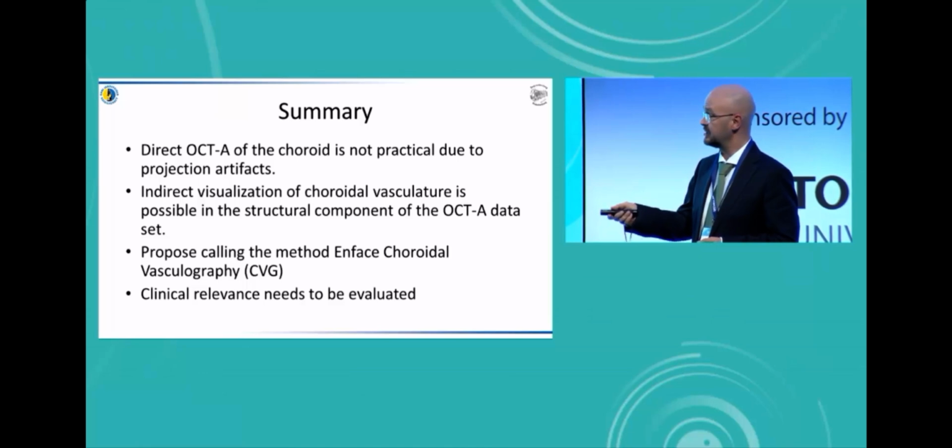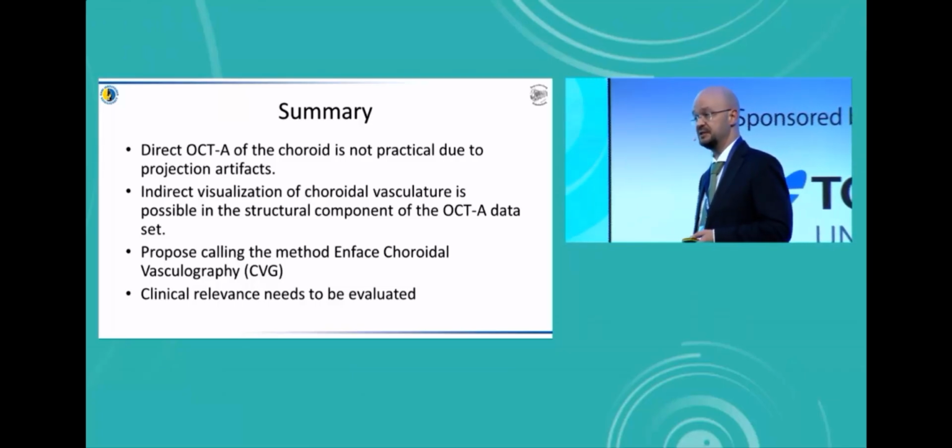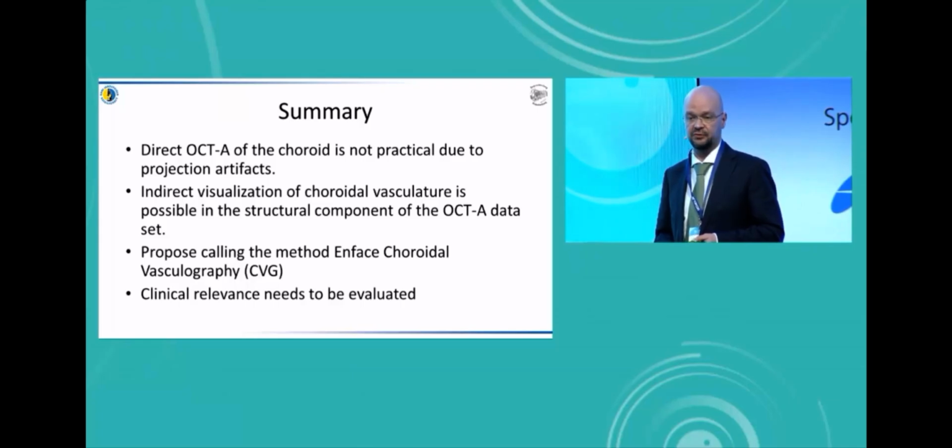Obviously, right now the clinical relevance needs to be evaluated. We need to look at this in different diseases and compare it to ICG. But in the end, I think that this could be a valuable tool for us that in certain diseases could make the need for an ICG less necessary.